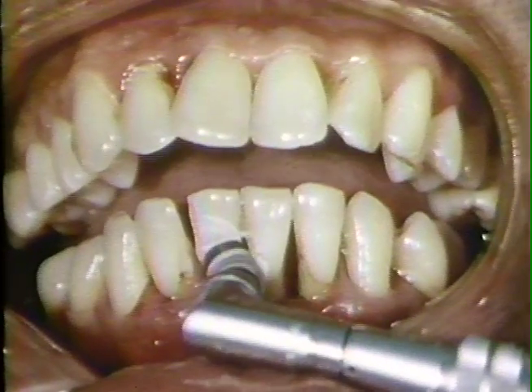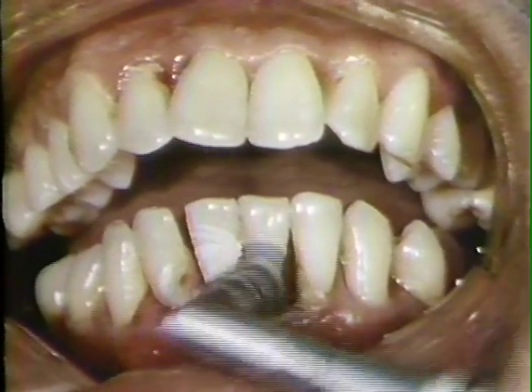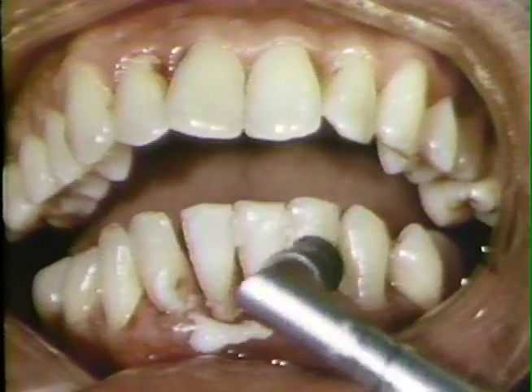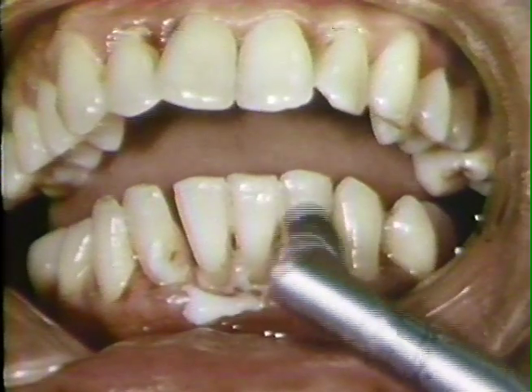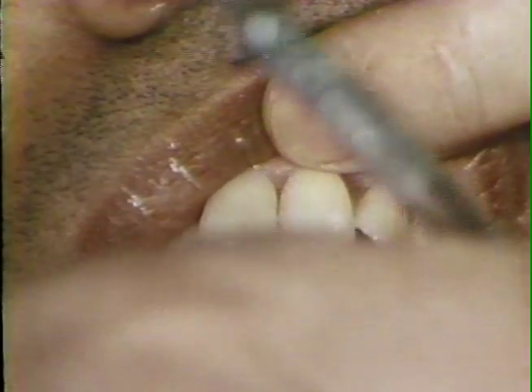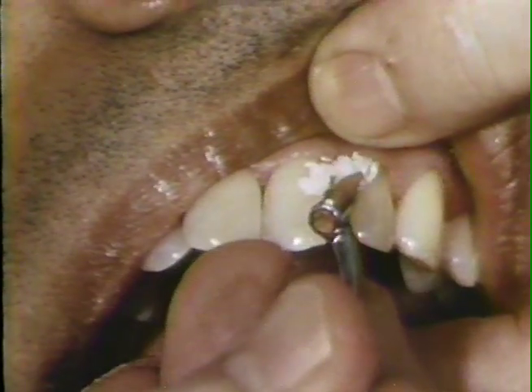Although the rubber cup is extended interproximally as much as possible, it does not provide adequate interproximal polishing. This is especially true in the mandibular incisor region. An orange wood stick or port polisher can be used interproximally and for the cemento-enamel junction.